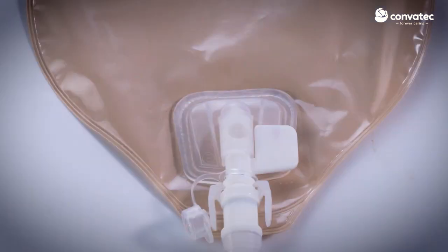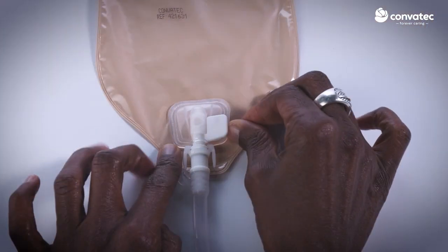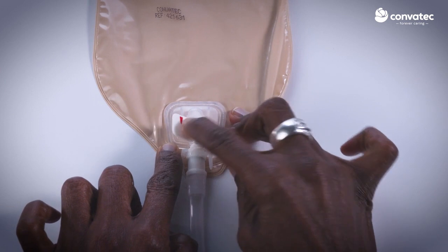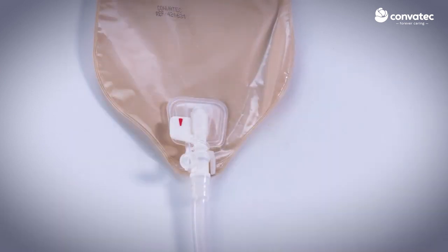Finally, the pouch will need to be open in order to drain into the container. To do this, rotate the AccuSeal tap to the open position. The colored mark on the tab shows that the tap is open.